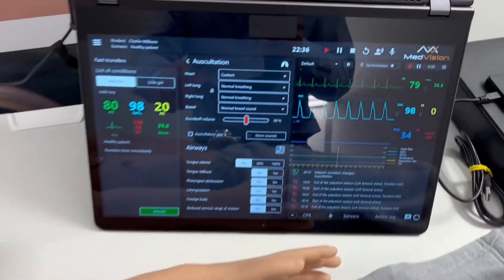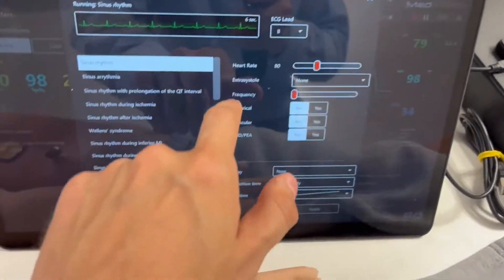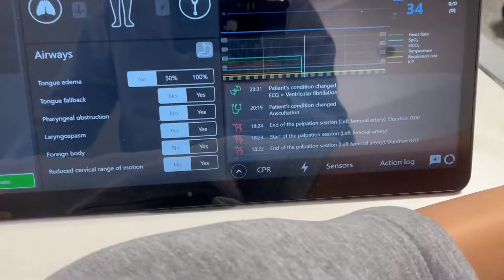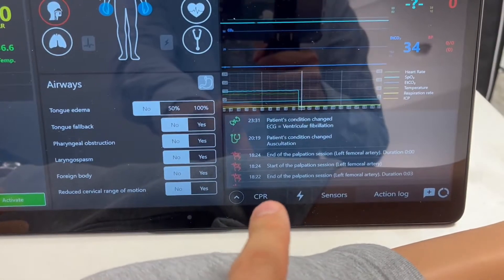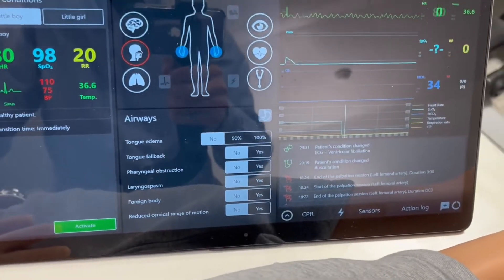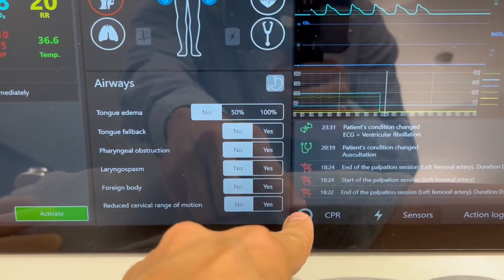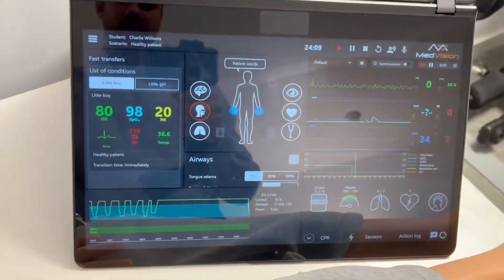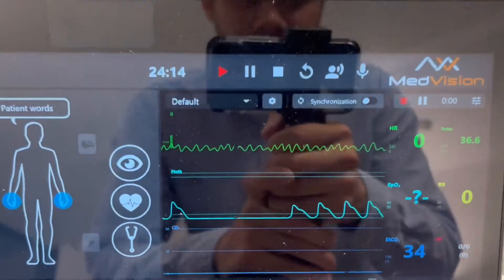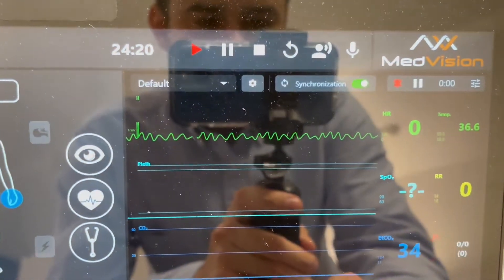To show some of the new software features, I'm going to go back and start doing CPR. You can see the CPR tab right there. When I start doing chest compressions you'll see what happens — instead of instantly popping up and obstructing the screen, it starts glowing. You can then press to choose whether you want to view the CPR data or not.